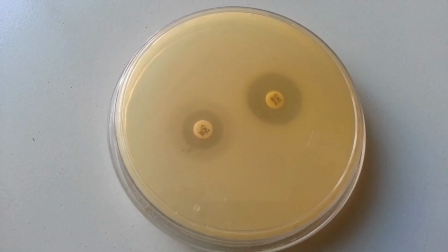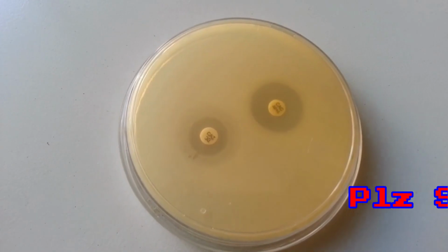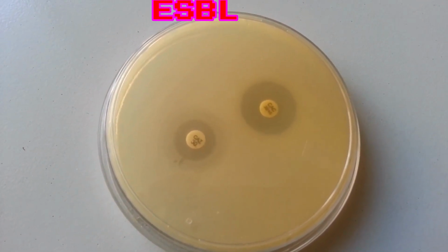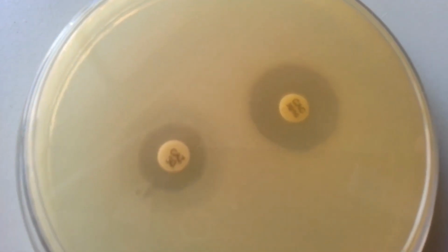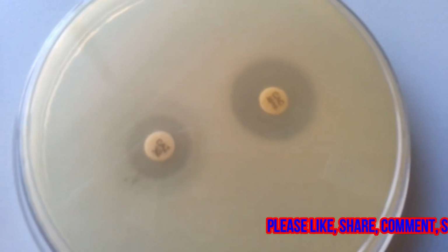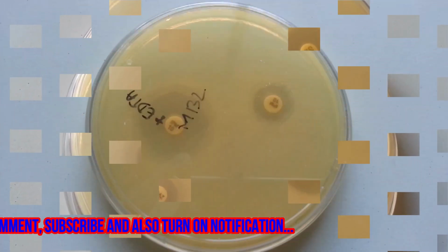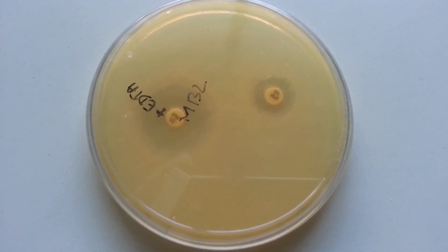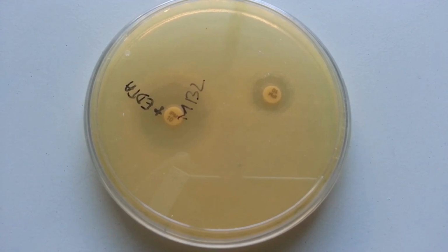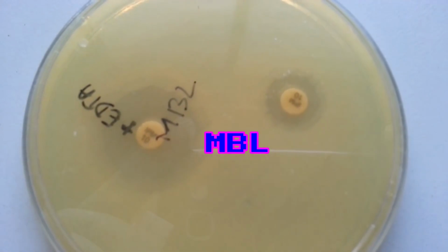Hello, today we are concerned with beta-lactamase detection, both screening and confirmatory methods. As we know, it is of four types based on molecular classes according to the Ambler scheme, that is A, B, C and D. So in class A, penicillinase including extended spectrum beta-lactamase.